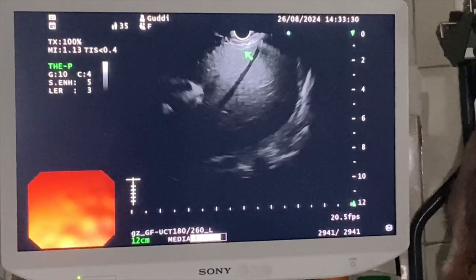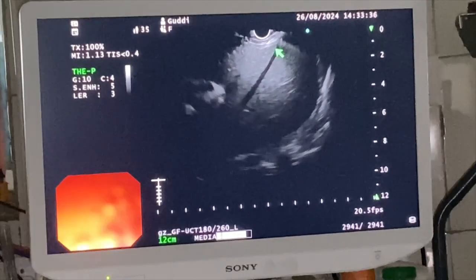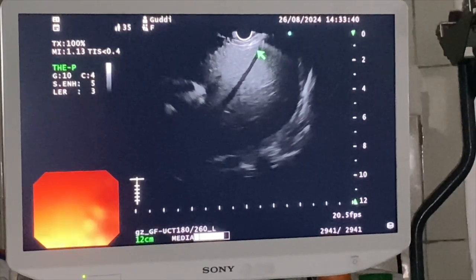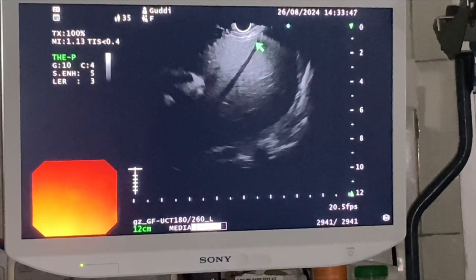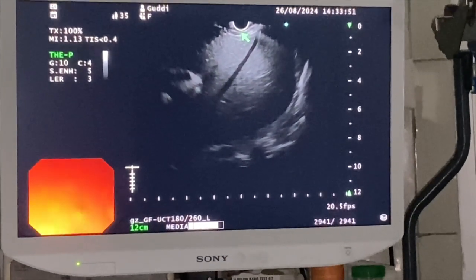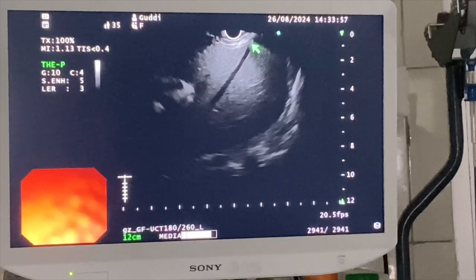Right hepatic vein has got a maximum caliber when it gets inserted into the IVC, and gradually it tapers down. And moreover, you won't find the ligamentum venosum over here, which is a bright white band, which is seen when we actually trace the middle hepatic vein.